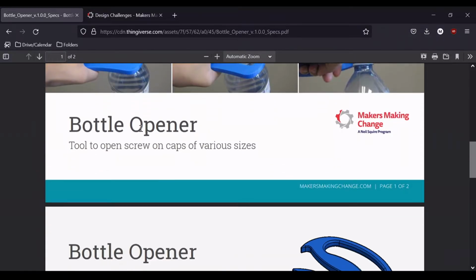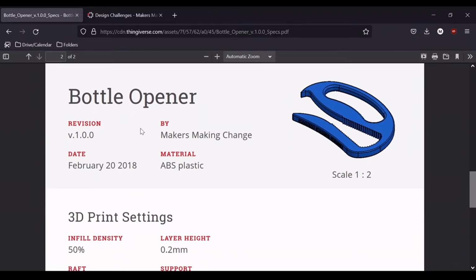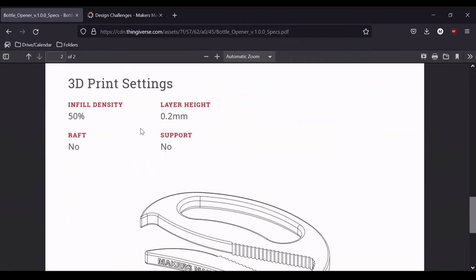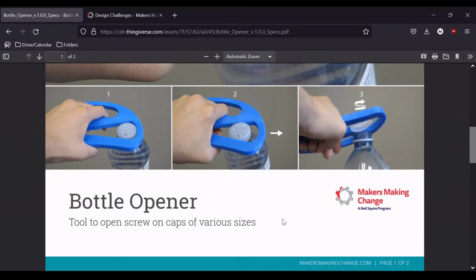In this case, we have a couple different instructional images on how the piece is being used. So if you're distributing this to somebody, this might be something worth noting and something that you can give to the individual when you give out the device.